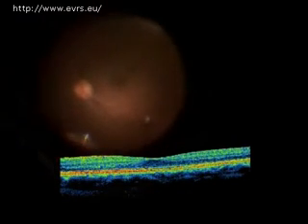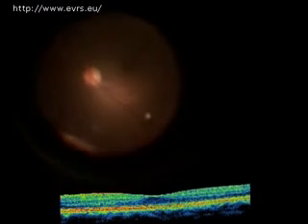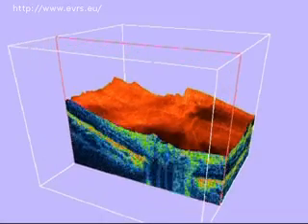The contour of the macula is completely healthy, and none of our observations had any influence on the final results, where 20/20 visual acuity was recorded in both operated eyes. Localized ILM detachment is better visualized with 3D spectral OCT.